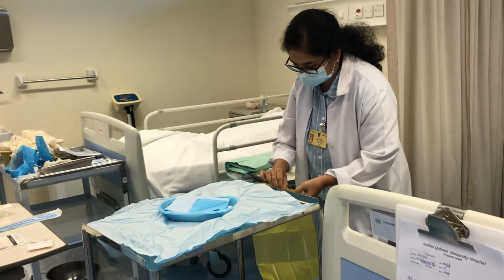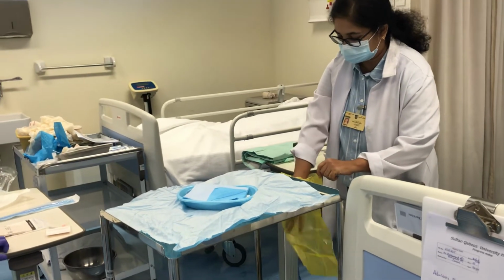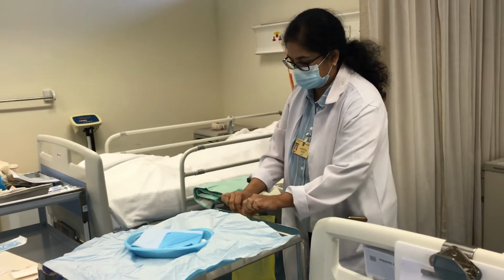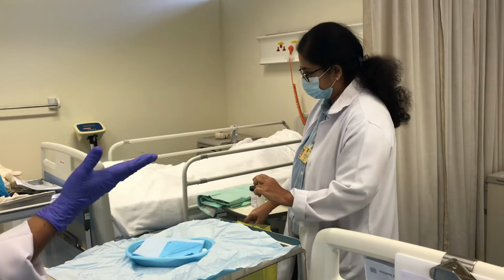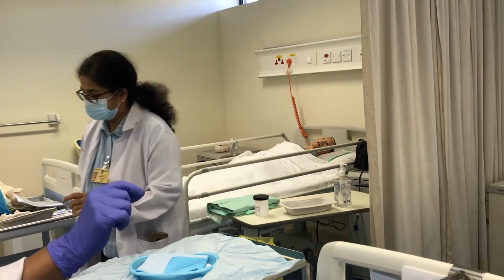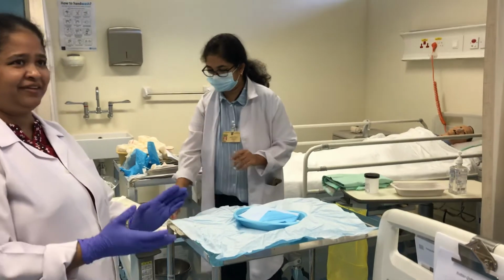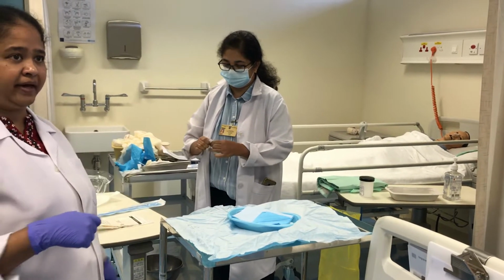So when you are inserting, when the urine comes, this is to catch that, for a urine specimen or to measure also. Sometimes the patient would not have passed urine for maybe 12 hours. So the moment you put the catheter, 1000 ml of urine will come. So we need to hold all that, measure all that, discard it, then connect it to the bag.